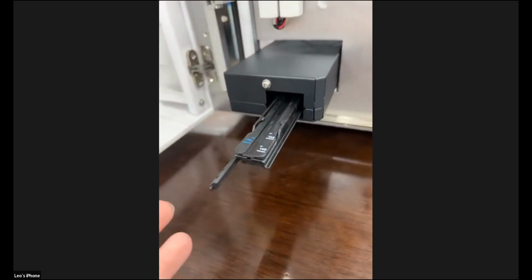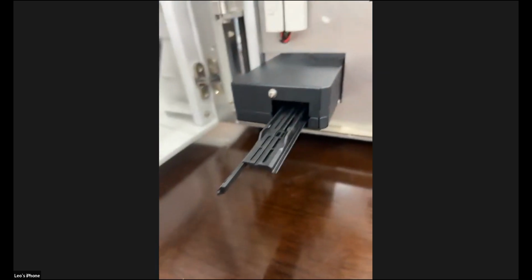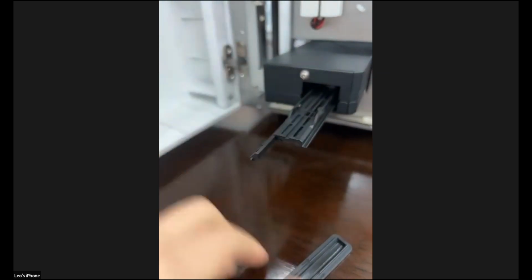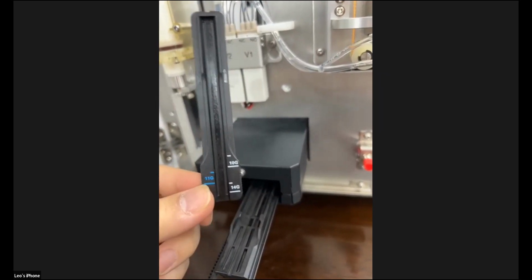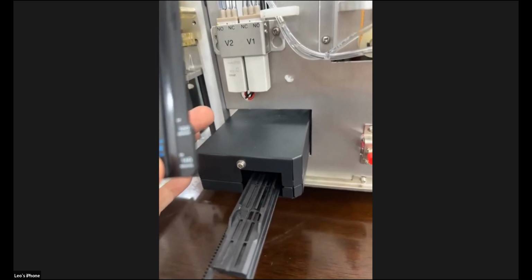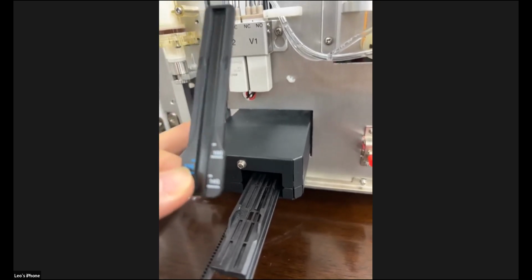When we maintain the strip holder, you can see that the strip holder will come out from the top, and then we can remove the slide of the strip holder, and then do some maintenance, including cleaning or other maintenance steps on this slide.